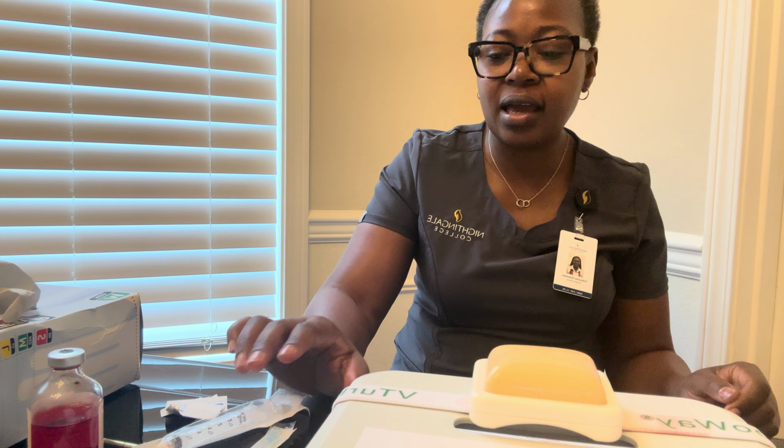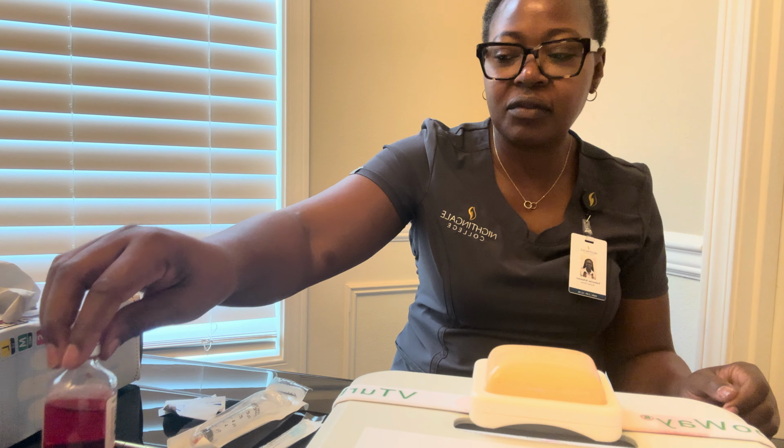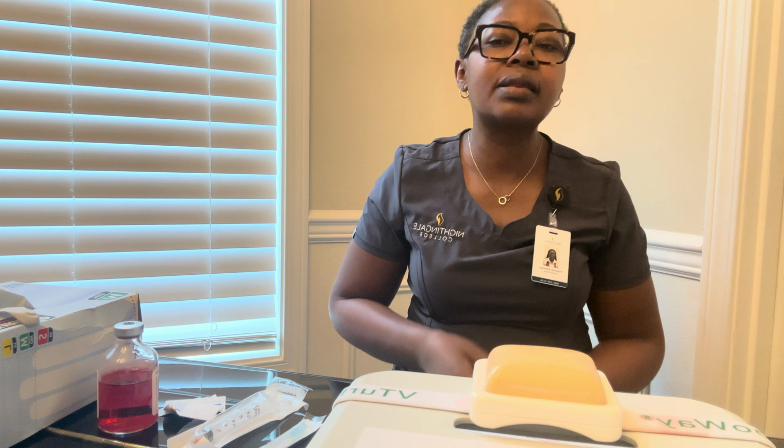I'm here to give an intramuscular injection, and I will start by gathering my supplies. I have a 3 milliliter syringe. I have a 1 to 1.5 inch needle. I have alcohol wipes. I have my medication. I have my gloves, and I have my gauze just in case.